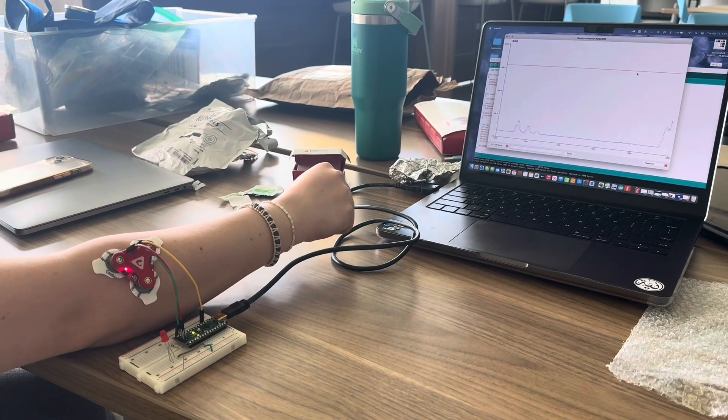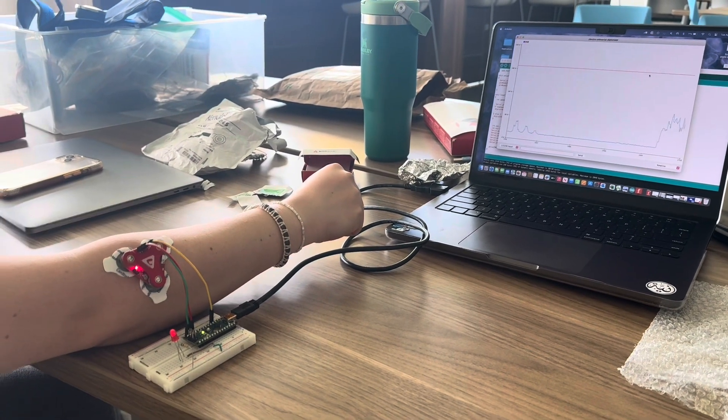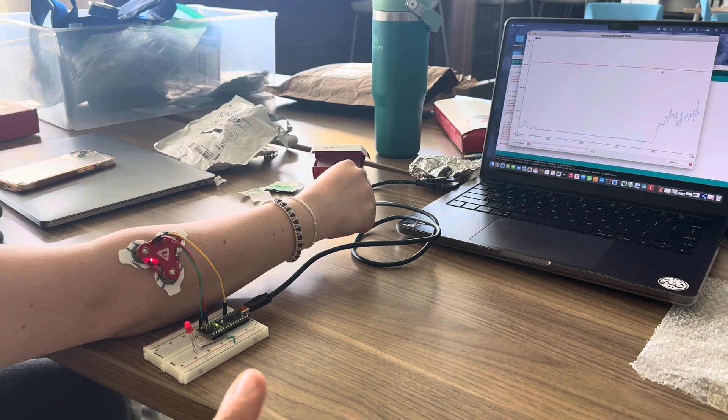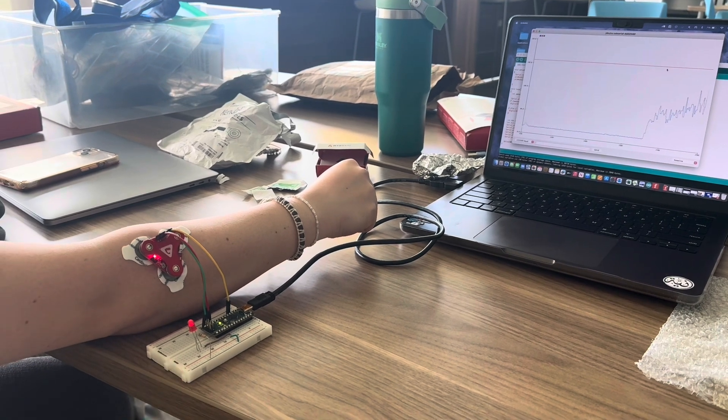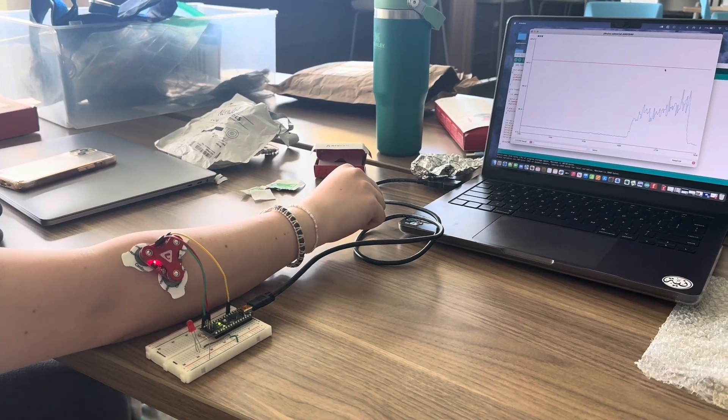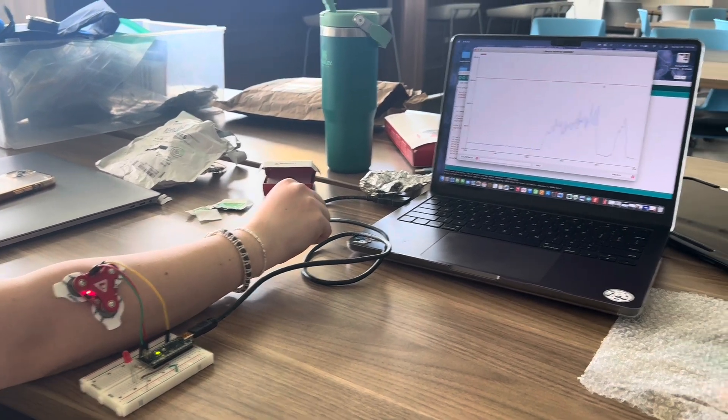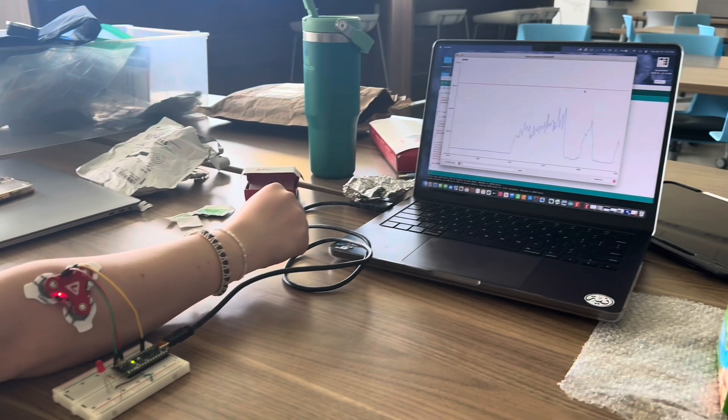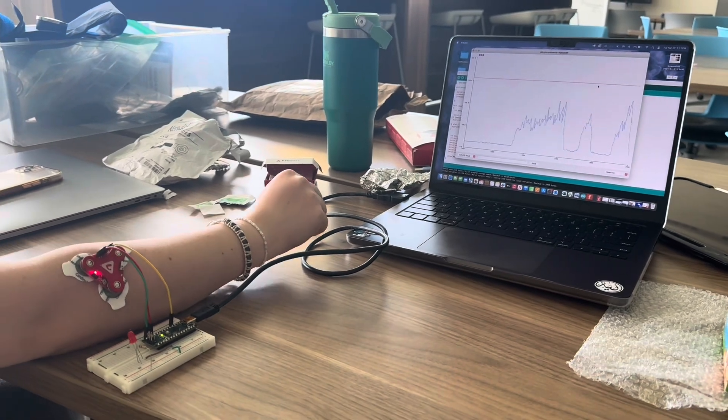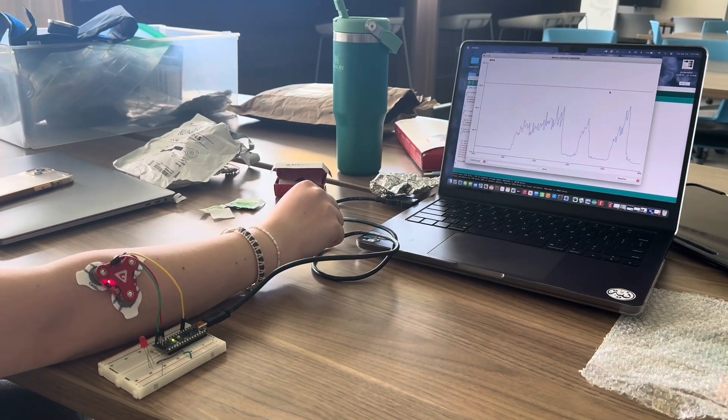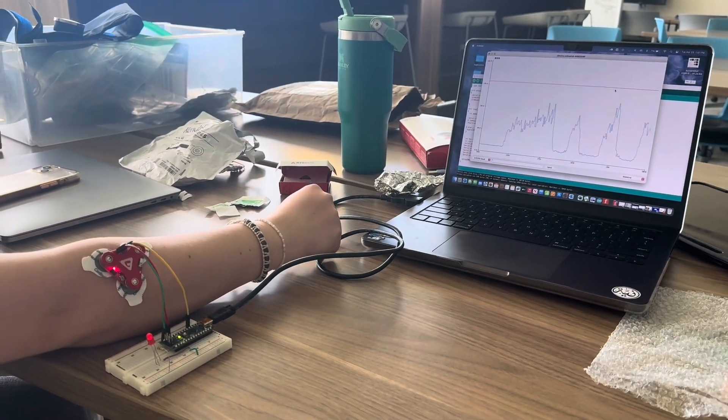This is the testing for the alert system. Here Karina is contracting and you can see that once she contracts and the EMG values are high enough the LED light turns on. When she stops contracting it turns off.